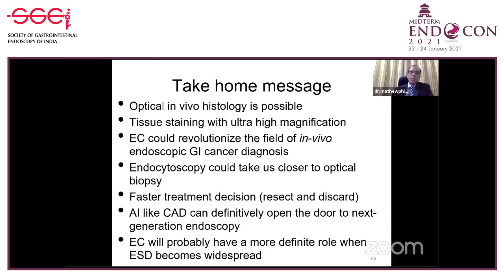So ladies and gentlemen, my take-home message for this new technology of optical in vivo histology is that histology is possible through endoscopy, but you need tissue staining and also a high magnification endoscopy, that is endocytoscopy, to get a diagnosis.